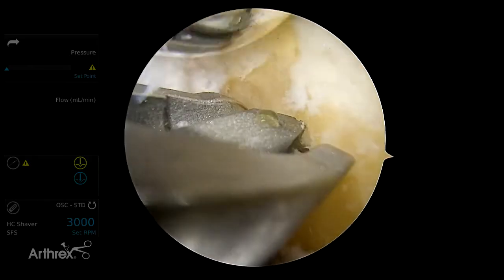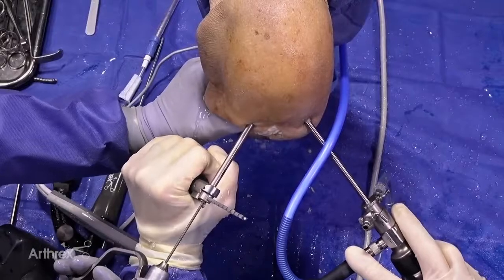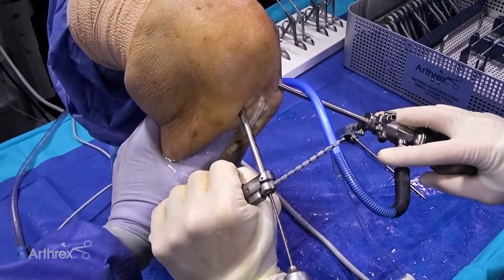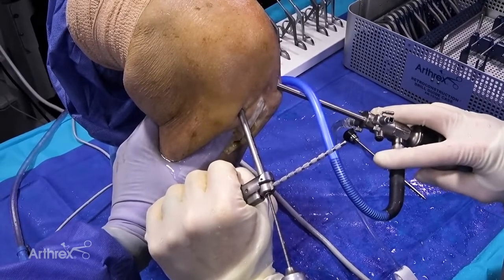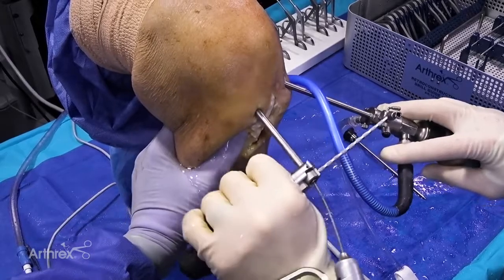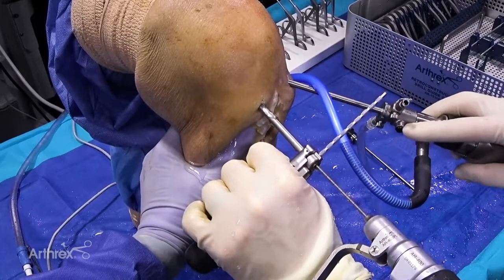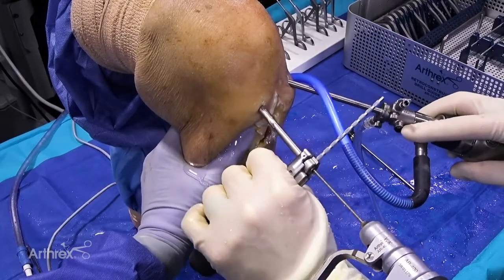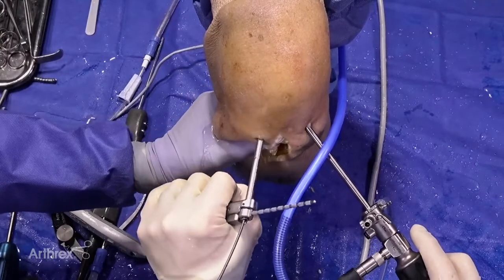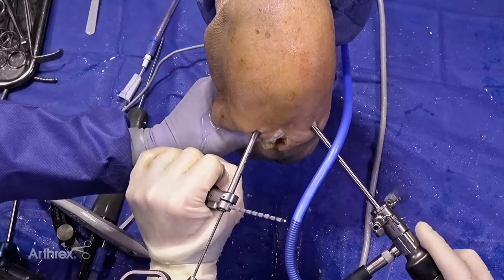The position of the hand is important here. This guide has an angle device — a vertical pin — which tells you where the wire is going to come out. I prefer mine at a 45 degree angle. You can change your trajectory to make it more vertical or more horizontal. For a revision you can actually deviate with a huge amount of flexibility away from previous tunnels and produce a divergent tunnel technique in just about any degree of freedom. For this primary ACL we're going to do it at 45 degrees.